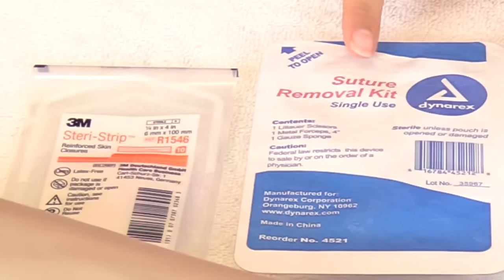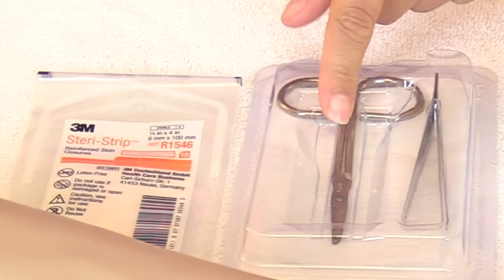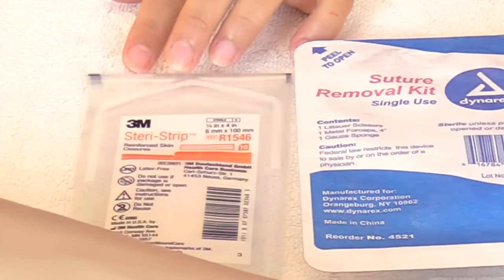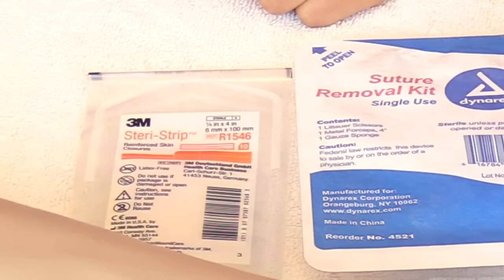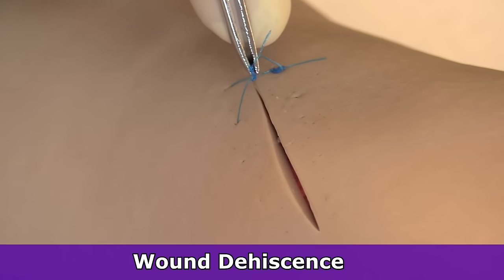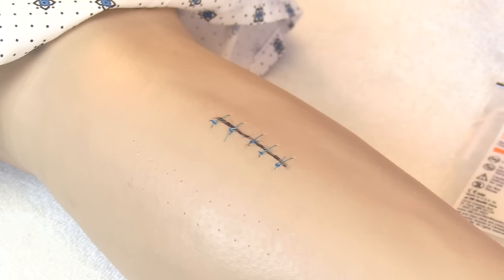You'll also need a suture removal kit, which comes with tweezers, scissors to cut the suture, and gauze to keep sutures in place. You'll also need steri-strips, which will be placed on the site where each individual suture was removed. One complication of suture removal is wound dehiscence — where the wound opens up prematurely — and placing steri-strips helps prevent that.